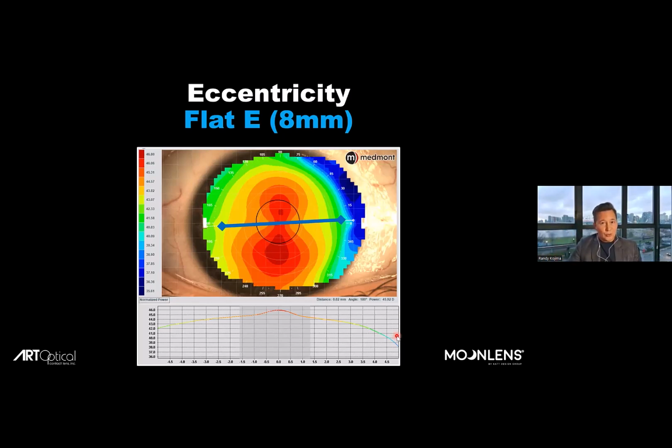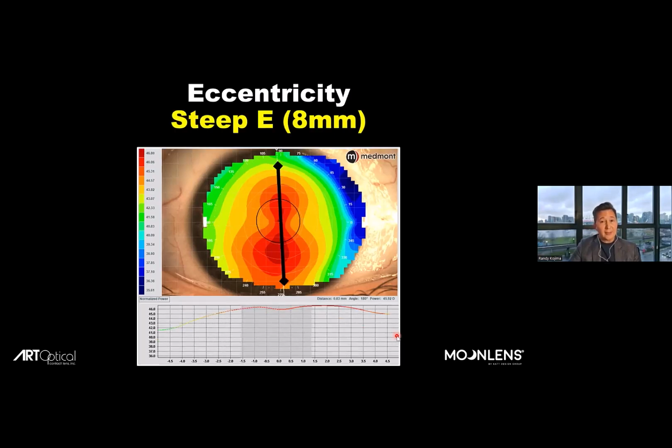That is also used in combination with the central radius, the R0 value, the radius at zero distance, to determine the depth of lens you need, the shape of lens you need for the alignment zone, also the base curve for calculating the right therapy target, the right mold shape. So all of these things go into the construction of the lens on both the flat and the steep meridian.